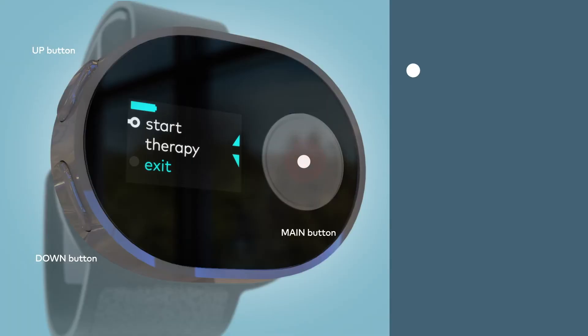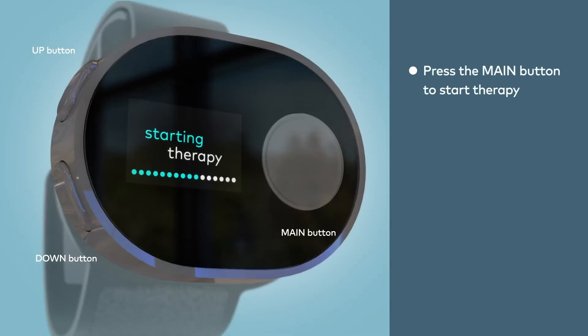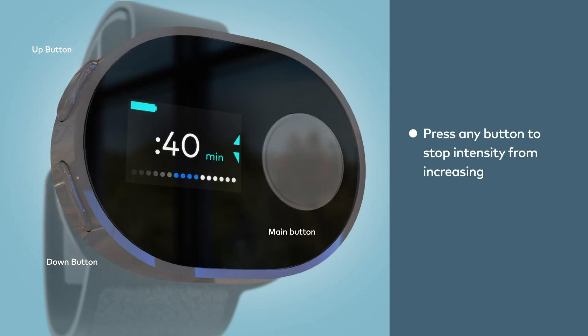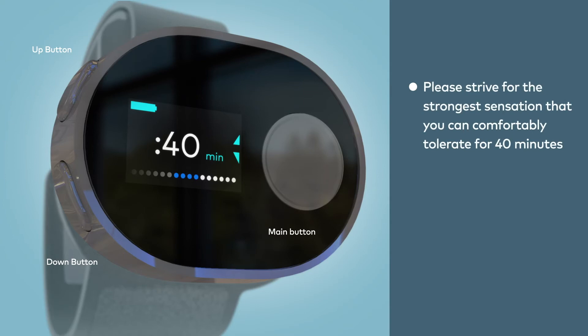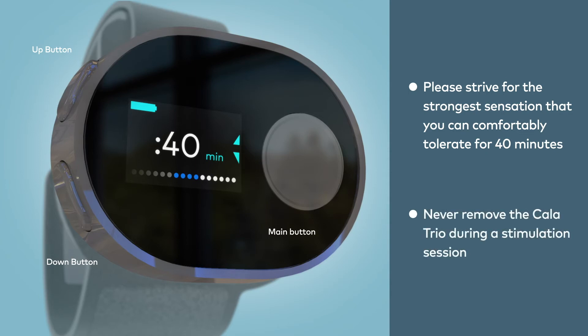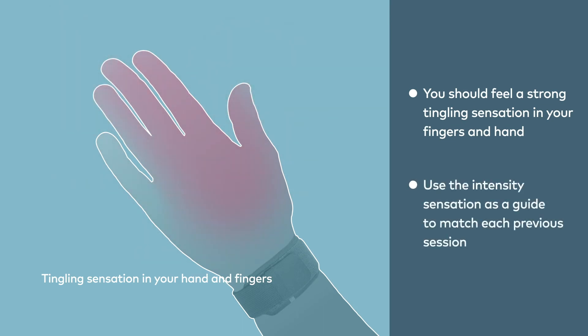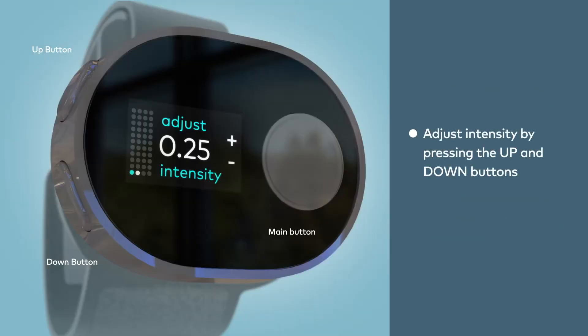After performing your tremor task, press the main button to start therapy. Calatrio will automatically ramp up to the stimulation level that you preset. If it feels too strong, you can press any button to stop the ramp up. However, please strive for the strongest sensation that you can comfortably tolerate for 40 minutes. Never remove the Calatrio during a stimulation session. You should feel a strong tingling sensation in your fingers and hand. Use this intensity sensation as a guide to match each previous session. If the intensity doesn't feel the same as before, adjust the levels by pressing the up and down buttons.